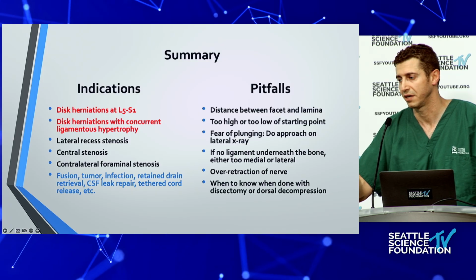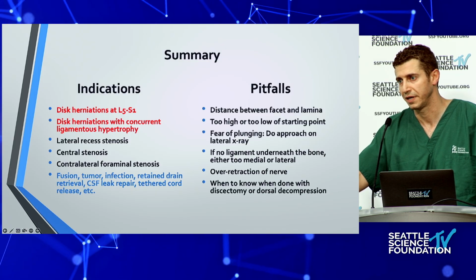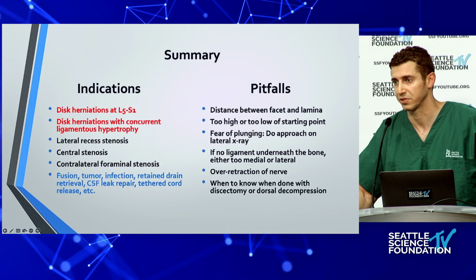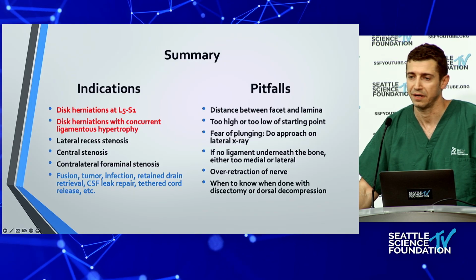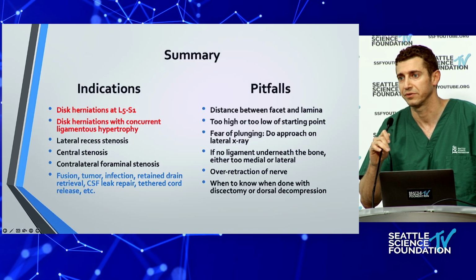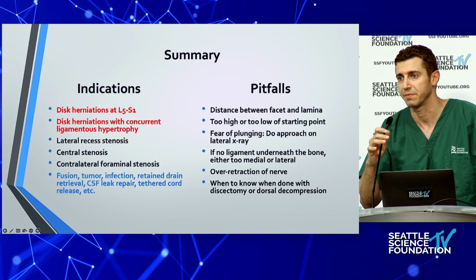Right. But again, it's because you fill up the dead space with glue, that non-expanding glue. It has to be non-expanding, and some type of dural substitute. And just call it a day. I don't know, Patrick, any thoughts that you have about durotomies and treatment of durotomies?